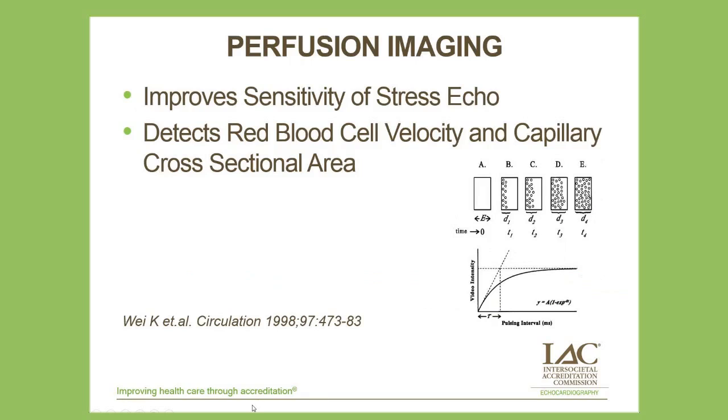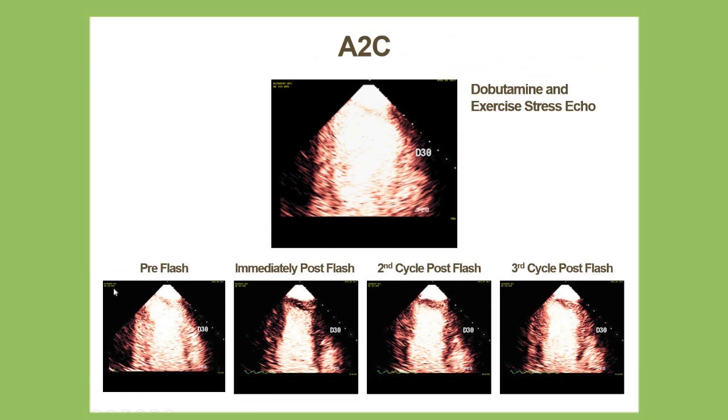The perfusion imaging that we do with ultrasound contrast and the very low mechanical index imaging is basically an extension of using it for left ventricular opacification, in that we apply these brief high mechanical index impulses during the study and analyze regional wall motion on the first images after the high mechanical index impulse, and then also look at myocardial contrast enhancement. And we found that a delay in replenishment that exceeds 2 seconds during any type of stress imaging is typical of a perfusion defect.